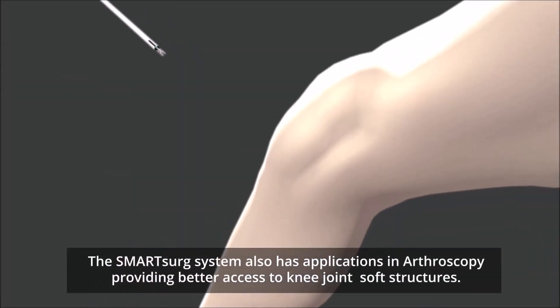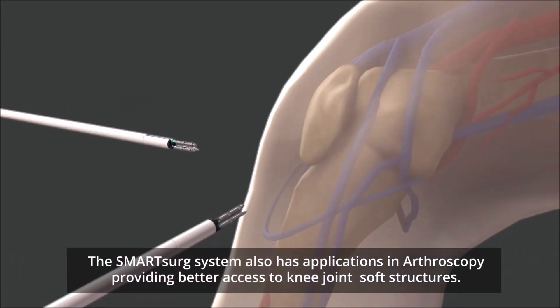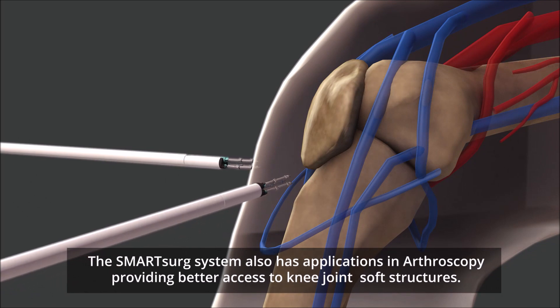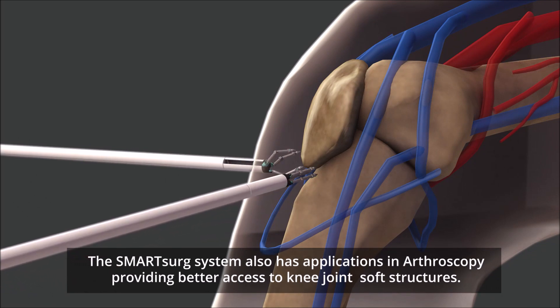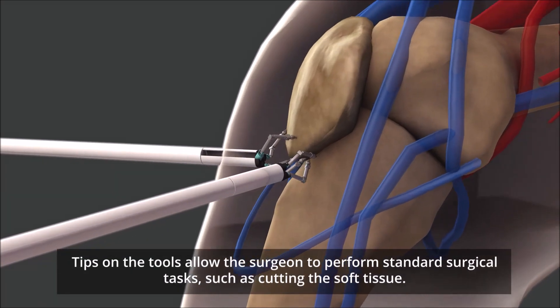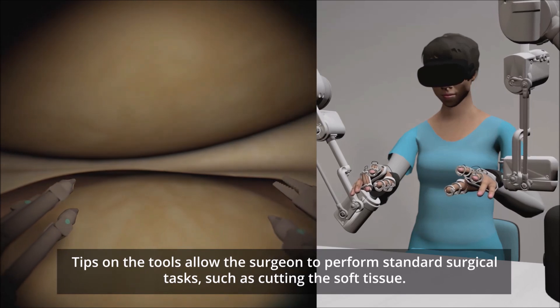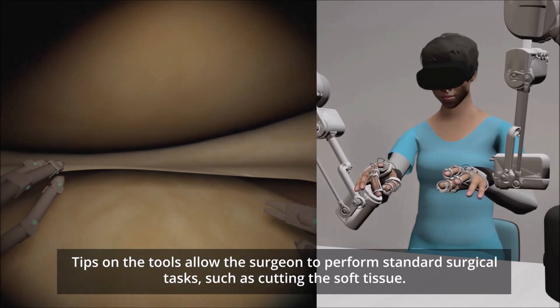The Smart Surge system also has applications in arthroscopy, providing better access to knee joint soft structures. Tips on the tools allow the surgeon to perform standard surgical tasks, such as cutting the soft tissue.